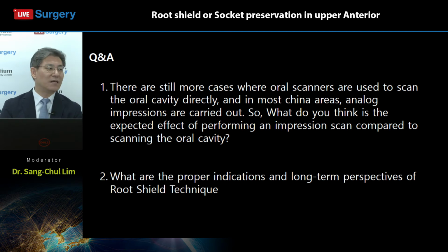Okay, so let's move to the post-op panoramic view, and the CT scan. Please wait a second. Yeah, we will show you.